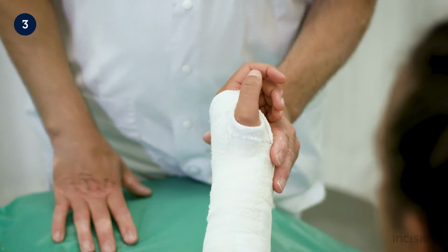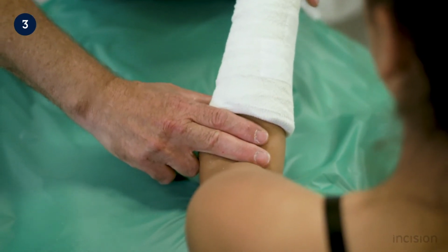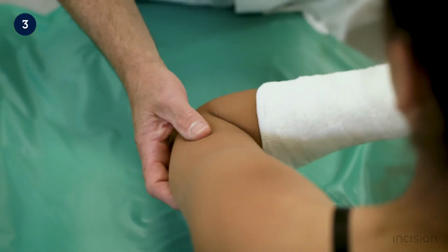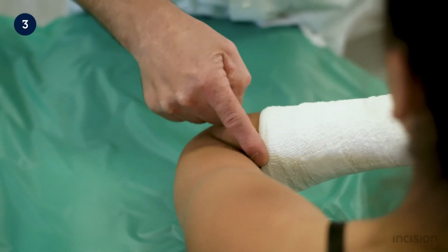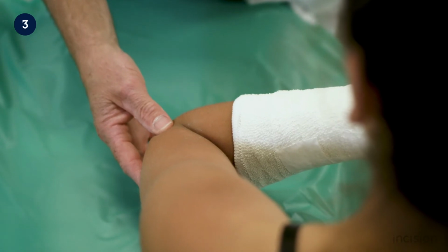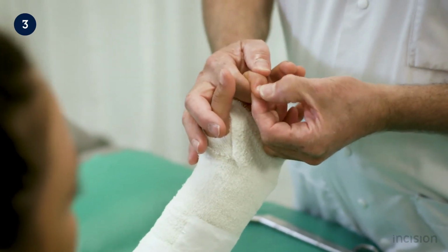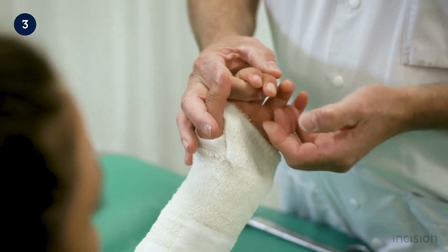The distance between the plaster and the elbow joint should be at least 2 finger breadths to allow bending when it is placed in a triangular bandage and to ensure that the plaster does not irritate the skin. Finally, the capillary refill is reassessed and compared to the initial findings.